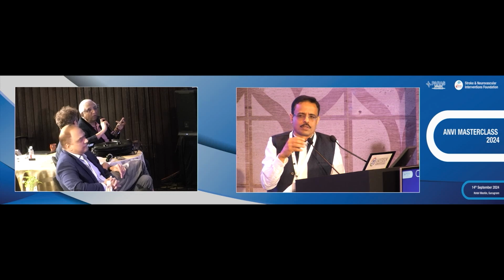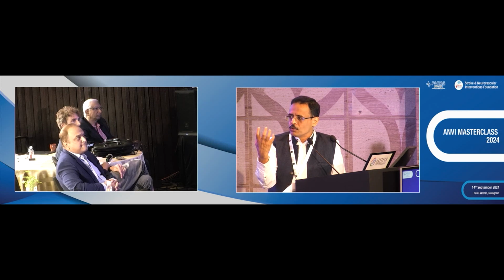Is it in the mid-segment where all the perforators are there? If you're going to use a coronary stent in a segment with the perforator, the chance of pushing plaque is much higher. So we just can't have one shot for everything. Balloon-mounted stents are very easy and convenient, but they are more costly. But yes, with balloon, you get a very good lumen and probably patency rates may be higher. We'll know the answer. But yes, internationally, balloon mounted stents are favored.